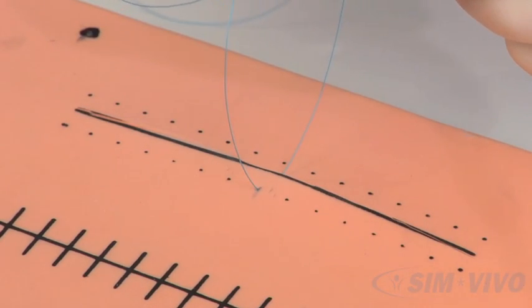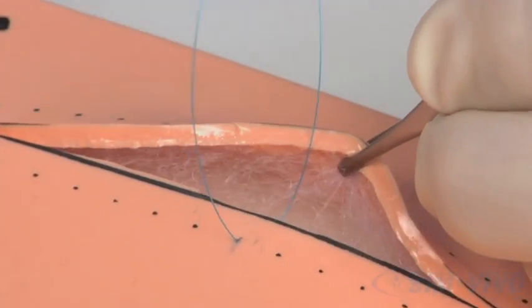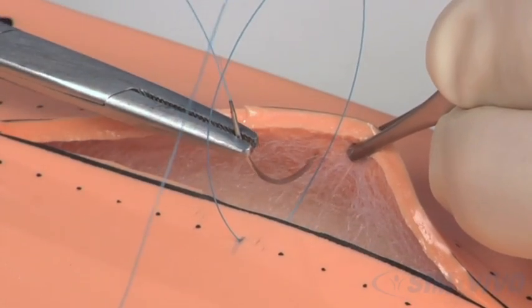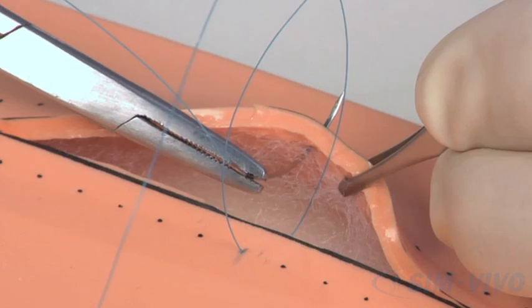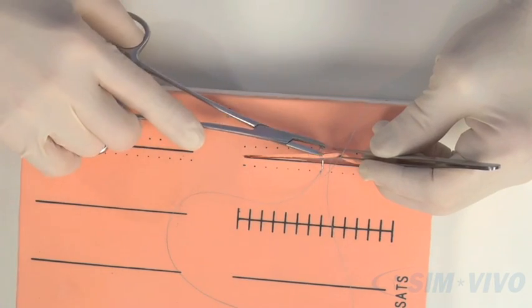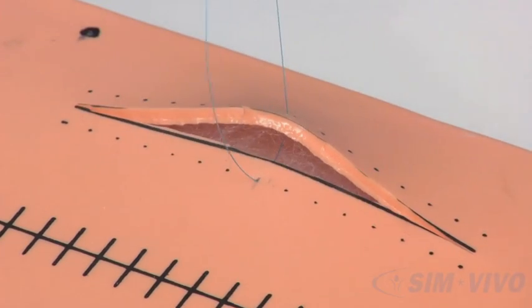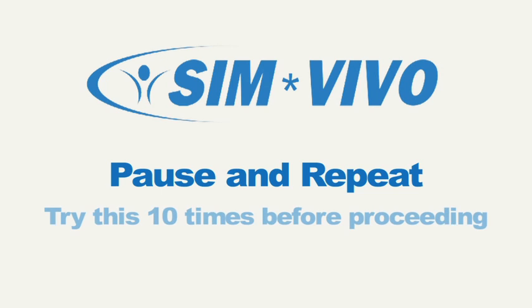Now reload the needle. Pick up the skin on the other side. Engage the skin at a right angle. Come out a little beyond the dot and pull the suture through. Now pull the suture all the way out. Practice this 10 times before continuing.